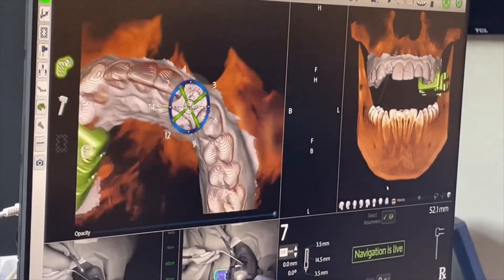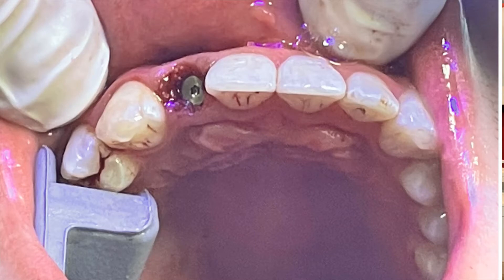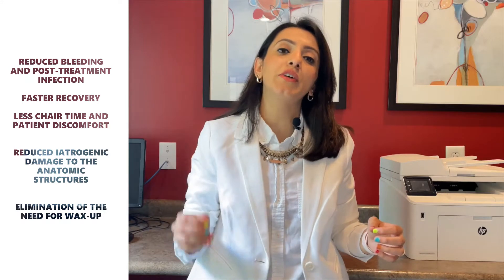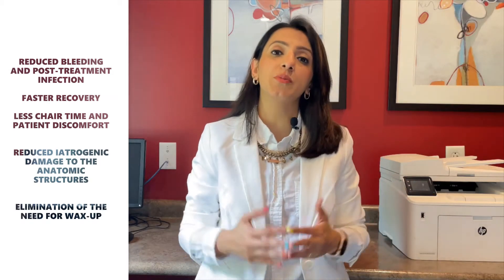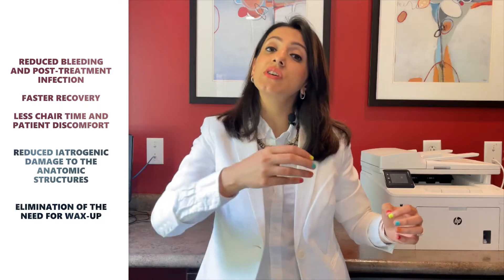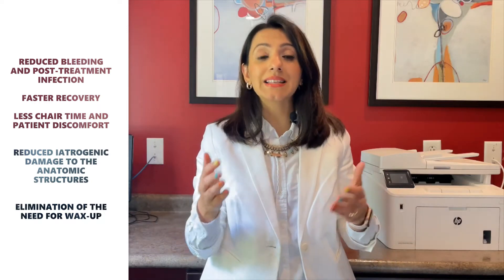This computer navigation surgery is a flapless or minimal-flap surgery, which enables reduced bleeding and post-treatment infection, facilitating faster recovery for patients, less chair time, and patient discomfort. It also provides reduced risk of iatrogenic damage to nearby anatomical structures like the nerves and sinus.